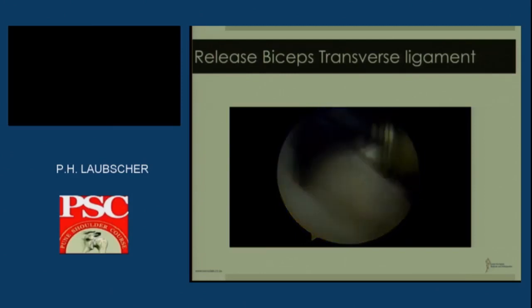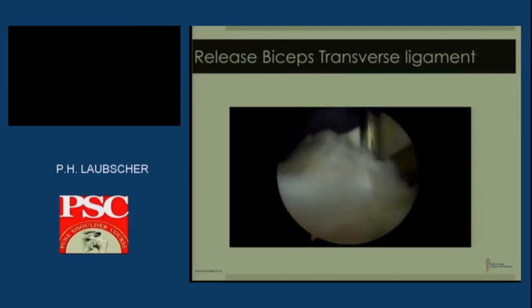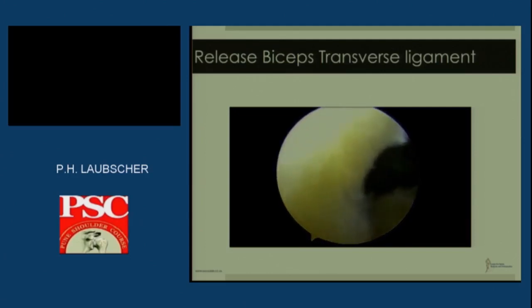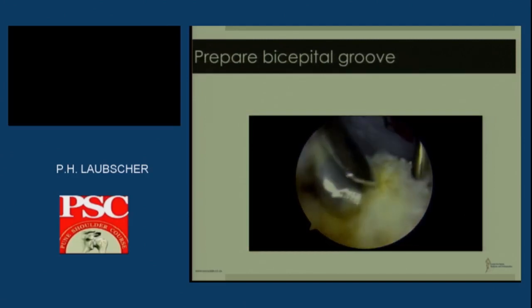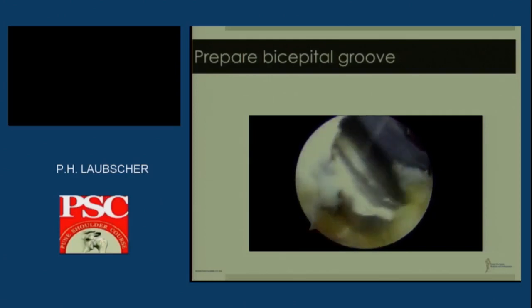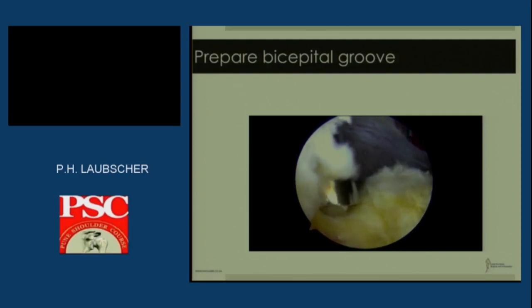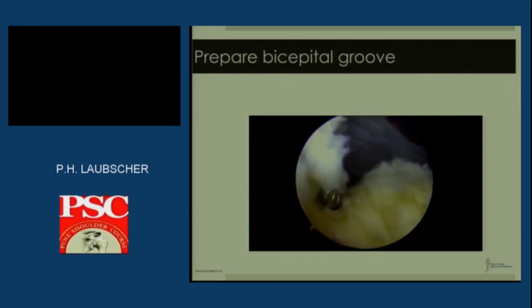What it also allows me to do is to remove my biceps from the groove and to allow proper preparation of the groove. I have an anterosuperior portal. This is more of an anterolateral portal. Through that portal I can bring my arthroscopic burr and I can prepare my bicipital groove. I can even deepen the bicipital groove, but I want to ensure that I have a bleeding bony surface.